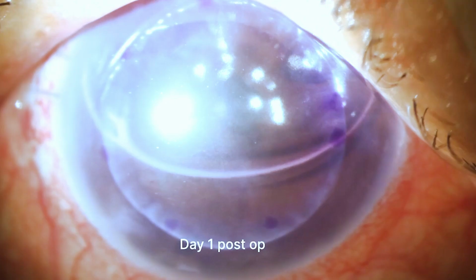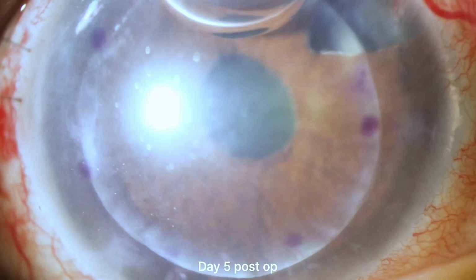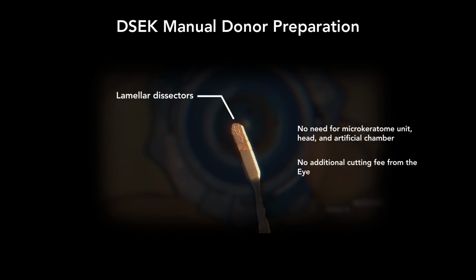These are day 1, day 2, and day 5 post-op photos. Manual DSEK donor preparation with the use of lamellar dissectors is feasible. There's no need for a microkeratome unit, head, and artificial chamber. It is a low-cost, accessible alternative in resource-limited settings. Thank you very much for watching.